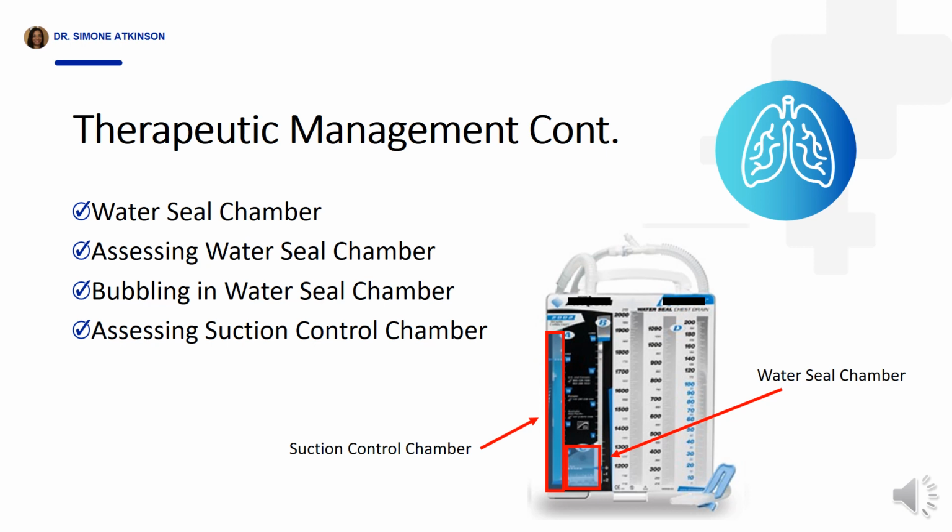Ongoing monitoring is essential. Evaluate the suction control chamber to ensure the correct suction level using the dial on the dry system or the fluid level as necessary. So add sterile water if the level is too low, and take care to avoid excessive wall suction, which can accelerate evaporation. Now, to remove excess water, aspirate it from the rubber seal within the chamber.